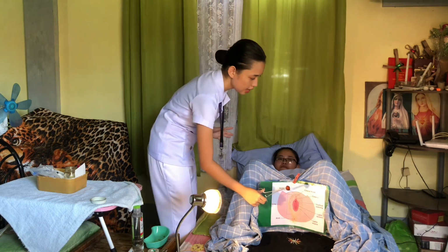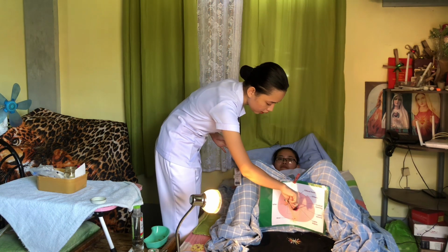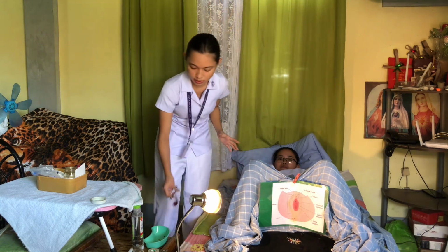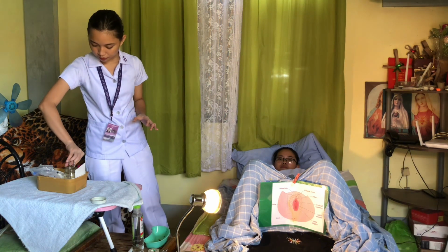So first, let's go down, and from here up to here, and then discard. Next, I'm going to use another cotton ball for the labia majora.